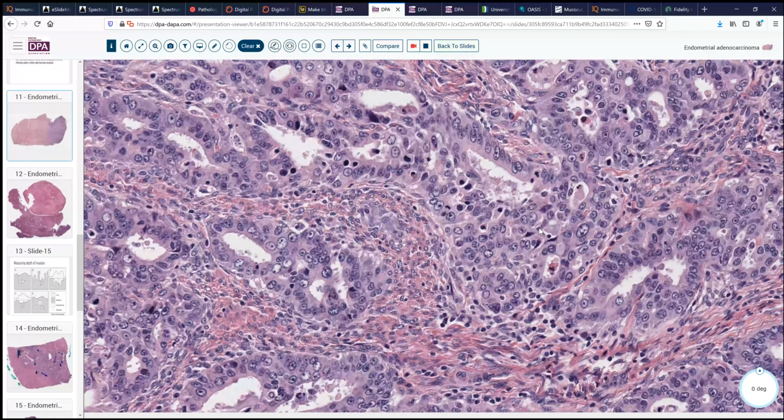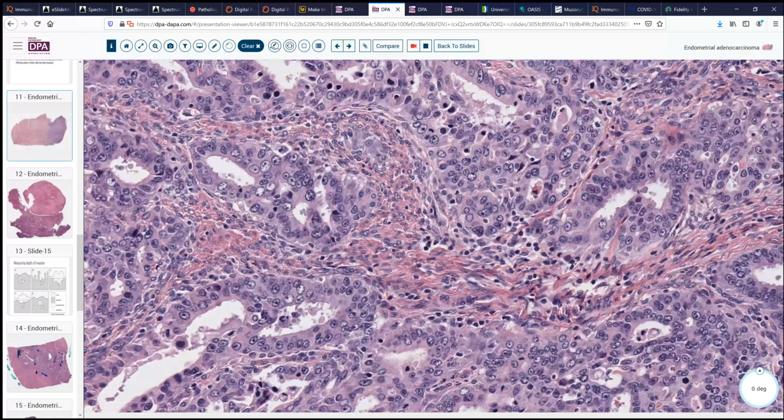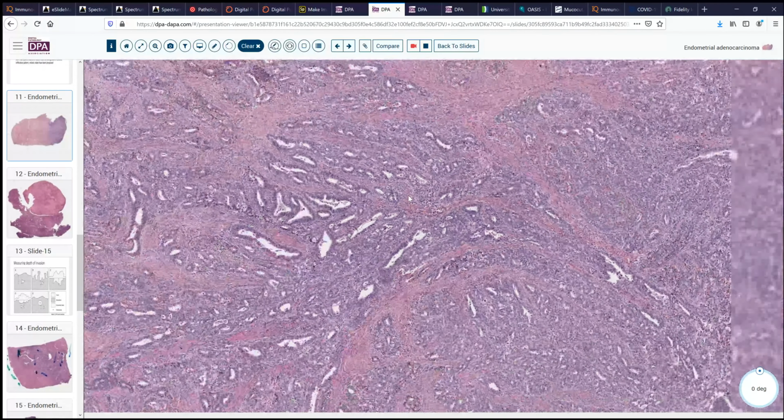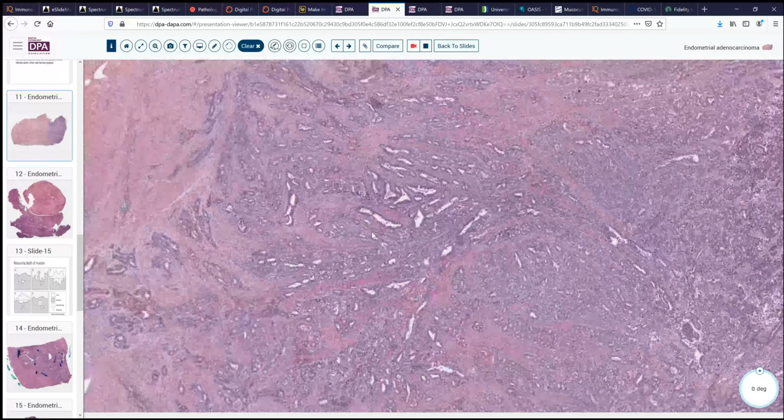There is an increased mitotic rate here. We do see mitotic figures and so forth. But we don't see very many nuclei, even maybe this one's here a little bit on the larger side, might make it almost to grade 3, but the overall grading, another one here, it's a higher grade type of nucleus that we would want to pay attention to, but overall we don't quite make it, I think, to a grade 3 nucleus. So this would be a nice example of a grade 2 endometrioid adenocarcinoma that is invading the myometrium.